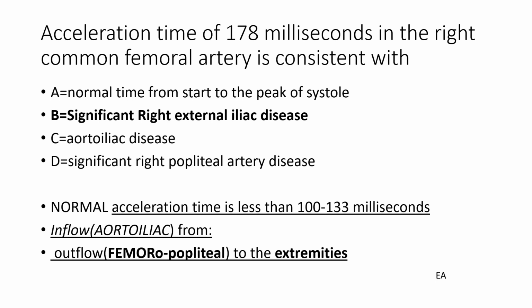Acceleration time of 178 is longer than 100 to 133 milliseconds, and it is about inflow or aortoiliac from outflow femoropopliteal. It is studied for the extremities.